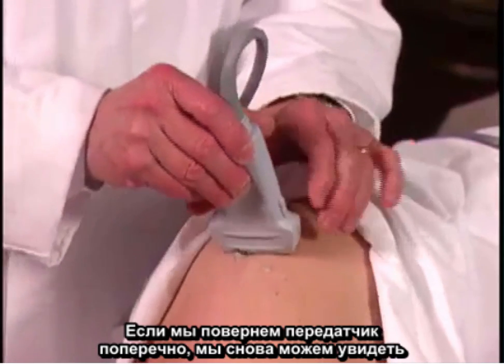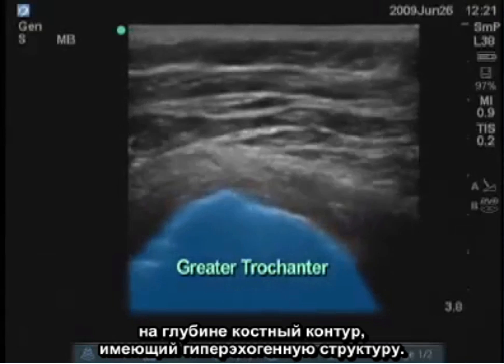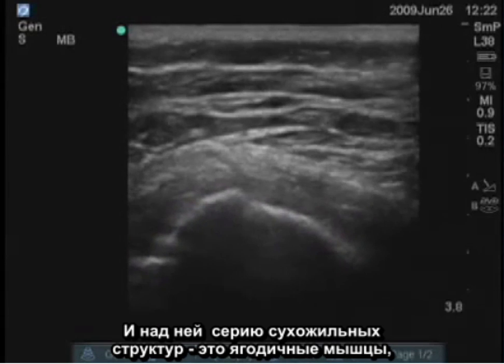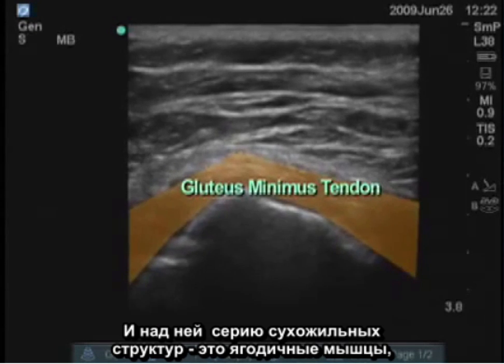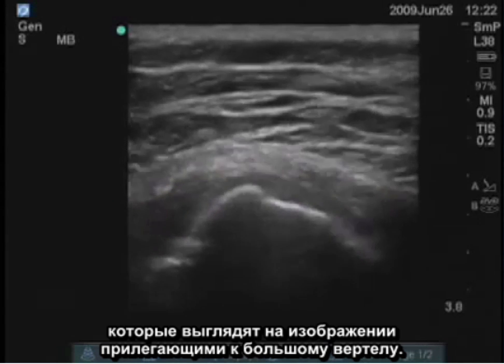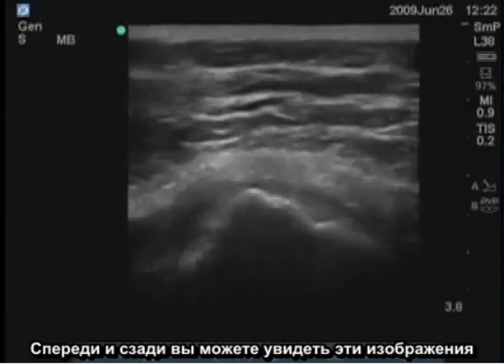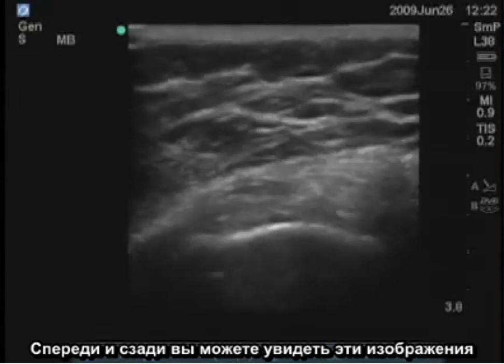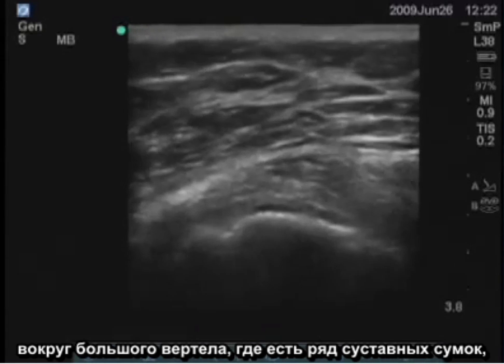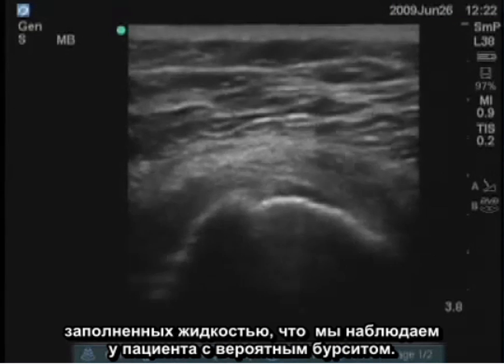If we turn this transversely, we can again see the bony outline deep as a hyperechoic structure, and above it a series of tendinous structures. The gluteus muscles come in and attach to the greater trochanter. Anteriorly and posteriorly, we can see these images around the greater trochanter. And there are a series of bursae present there, with fluid-filled sacs visible in a person who would have bursitis.